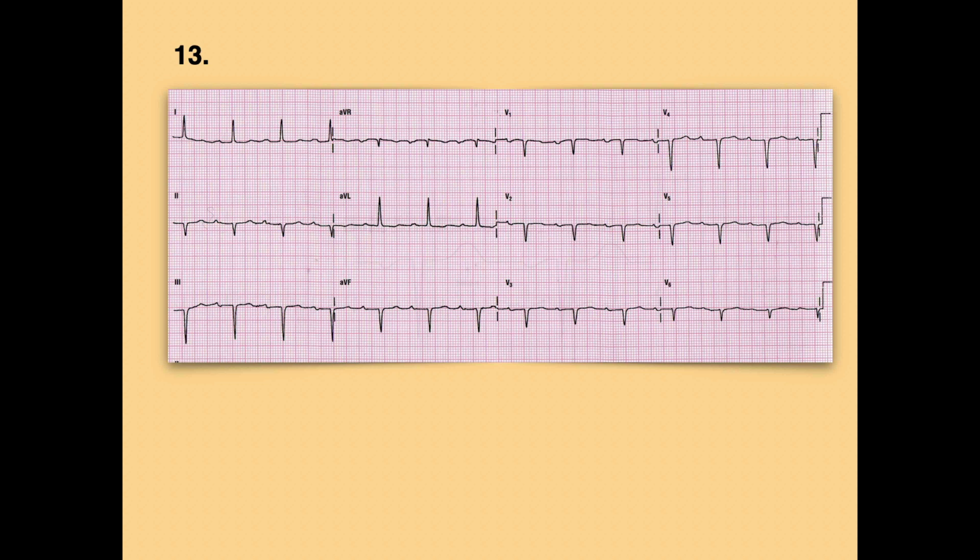There's cues, yeah. Absolutely. Okay. Yeah, because remember, if a QRS is just one negative deflection, we think of it as a Q. And would you call this pathologic, based on our three different criteria? It only needs to fit one.